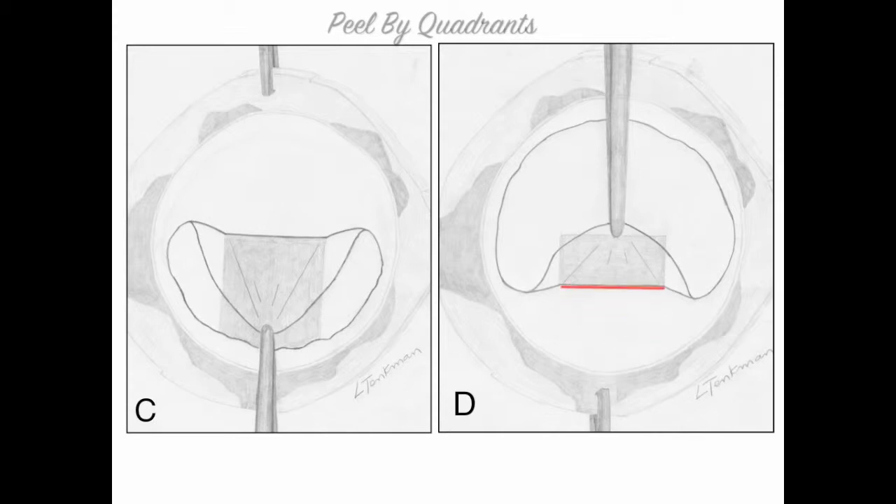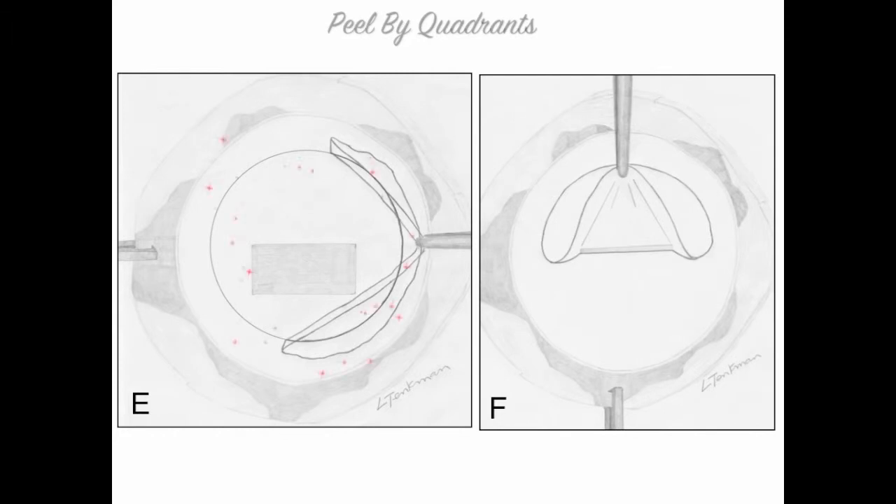The fourth peel I don't take all the way to the center because I have to leave the donor attached for the next step, which is trephination. After trephination, I remove the outer skirt of Descemet's Membrane, which has a ragged edge and dead endothelial cells — we don't want that on the donor. The actual donor tissue only has to be touched one time when it's peeled, and the donor will separate when the forceps get right there, so I don't risk dragging the endothelial cells on the opposing scleral rim.